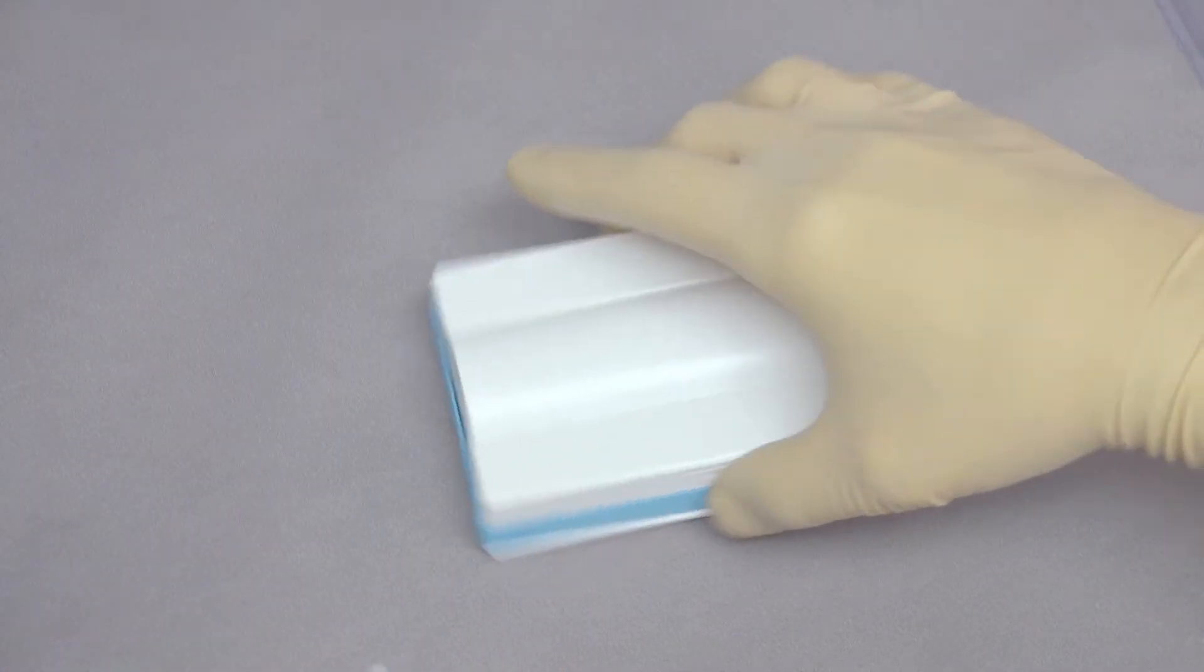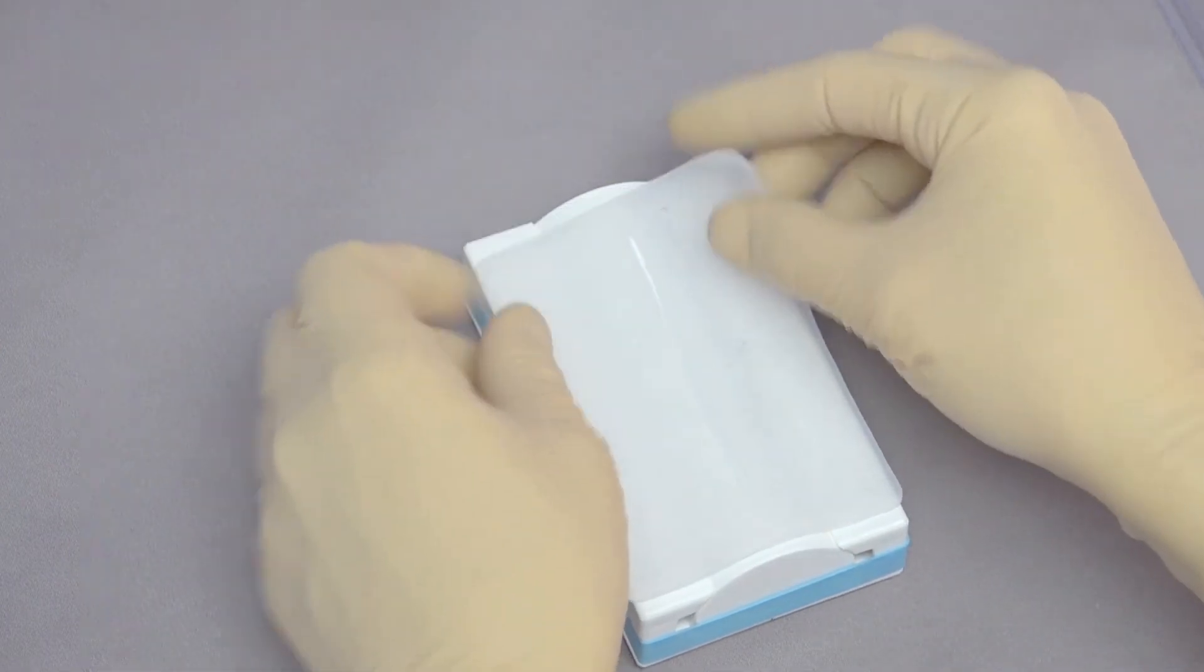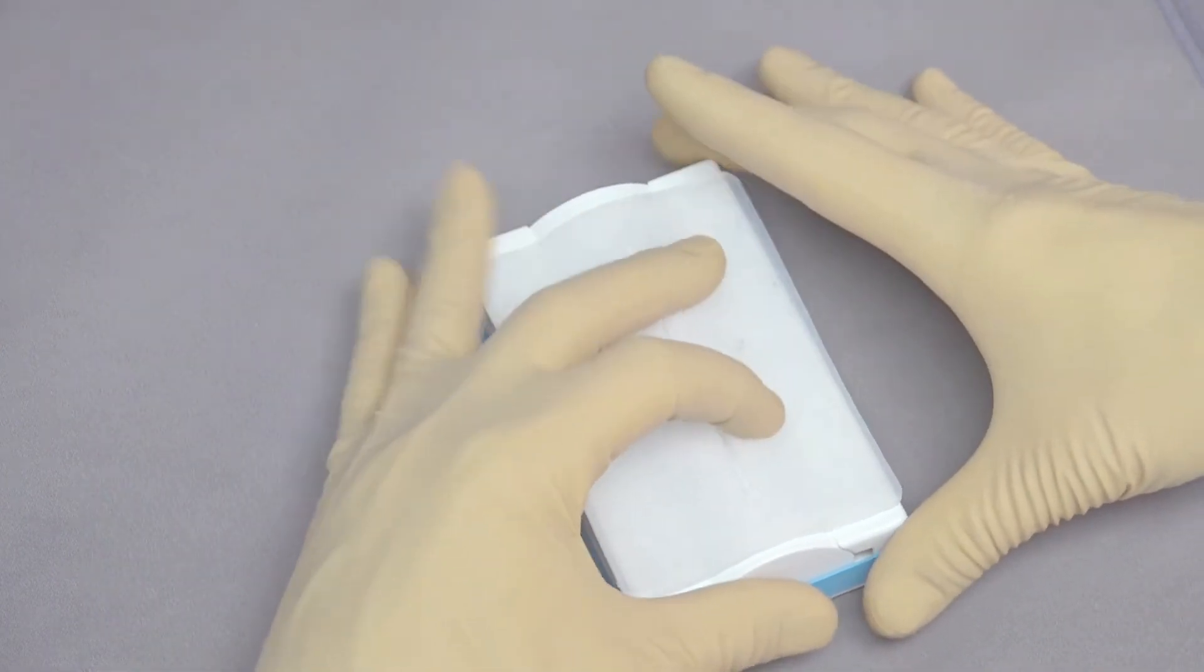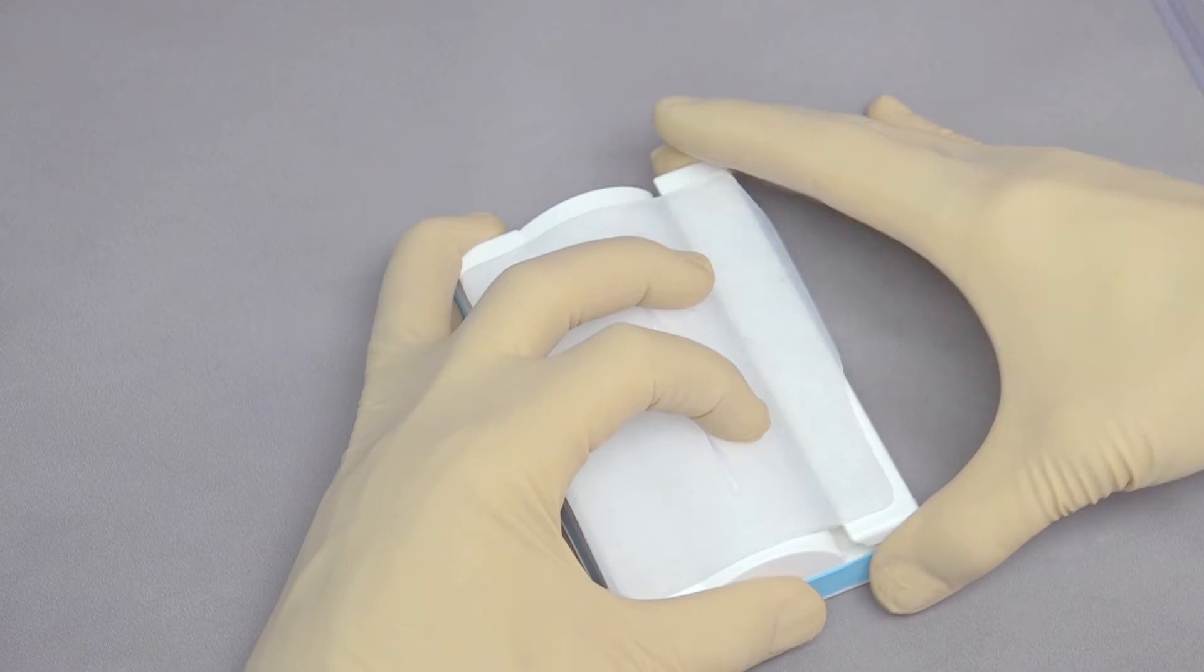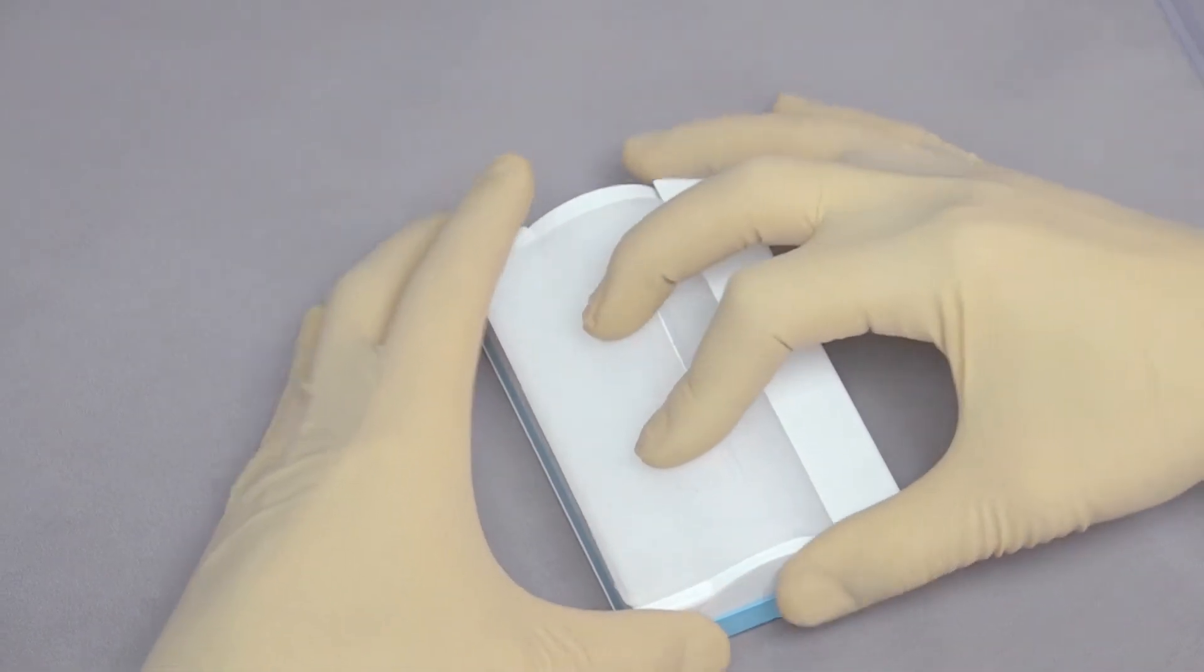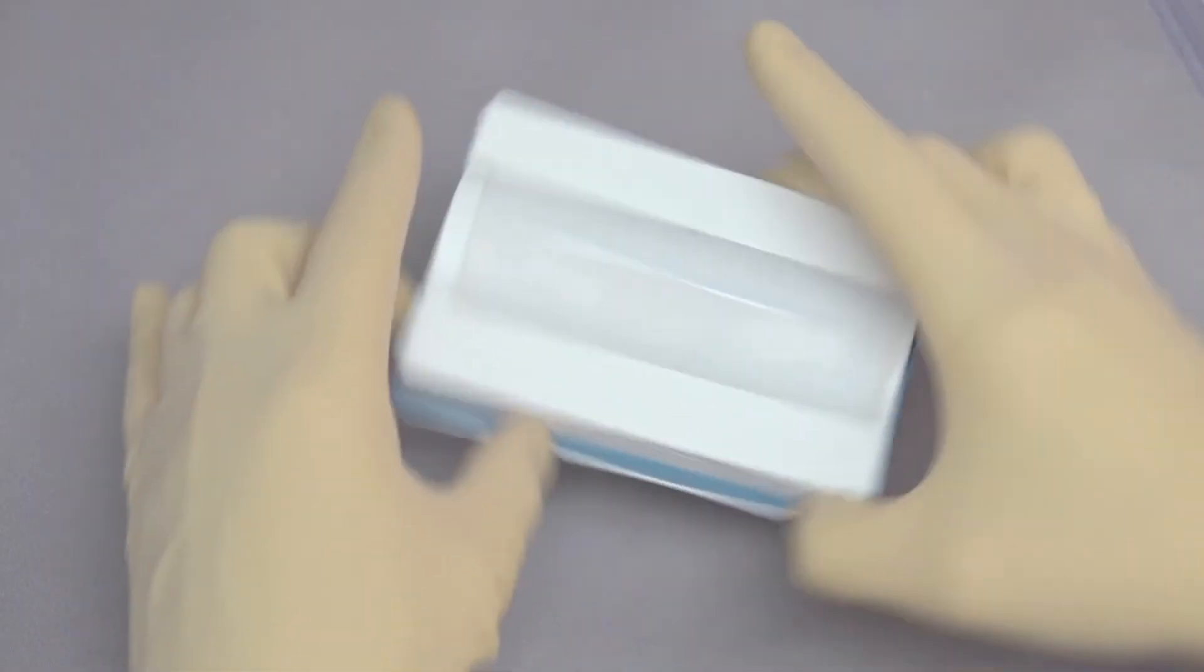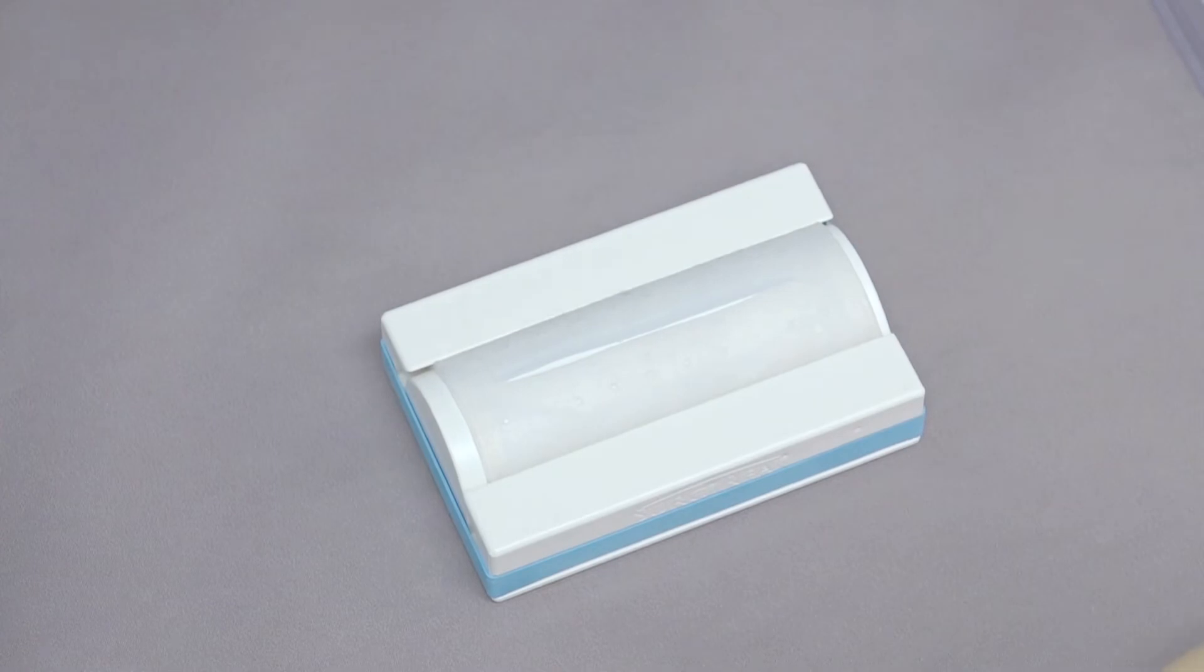To place that into our tensioning base, we put the incision right in the middle of the base, hold just on the right side of the incision, open that up and tighten. Left side of the incision, open that up and let that come together, and then that will provide support for our suture.